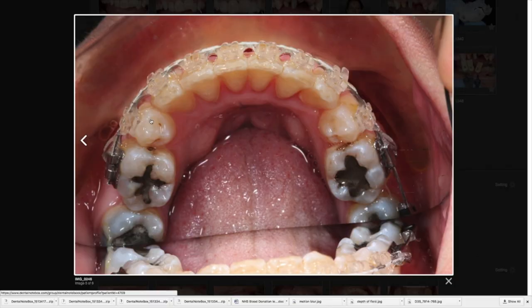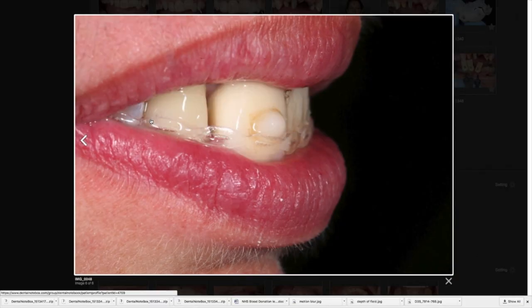This is the kind of photo I use to judge how far back these teeth need to go. She does have a skeletal class II pattern, so we're never going to get the incisors into a class I, and we don't really want that anyway - there's always going to be this lip issue. But when she says the letter F, I want the incisal tip to be as close to the wet-dry border as possible, preferably inside. You can see the wet-dry border and incisal edge relationship is pretty good at this point. I felt good, so we made an appointment to take all the ortho work off, do the bridge prep and everything.